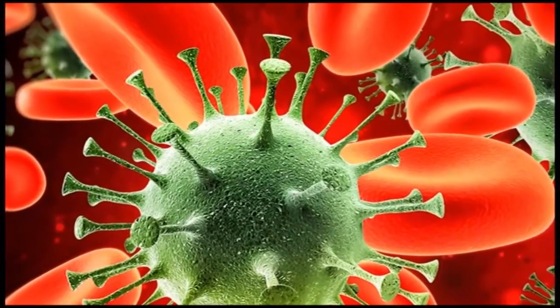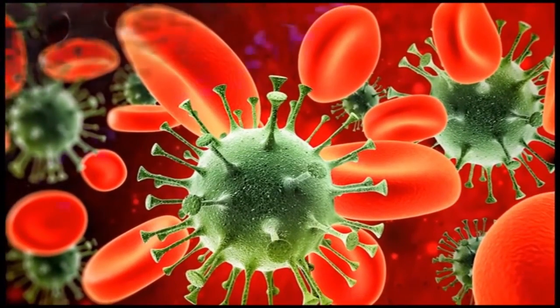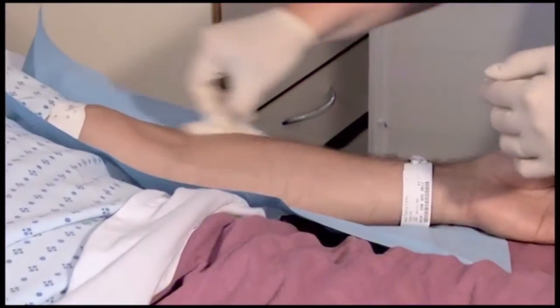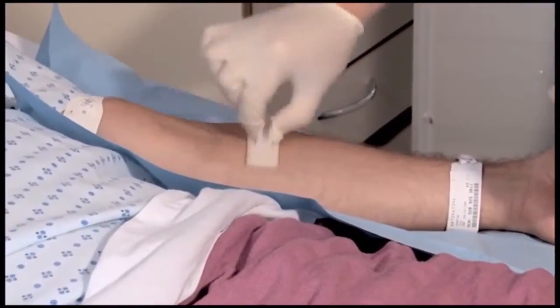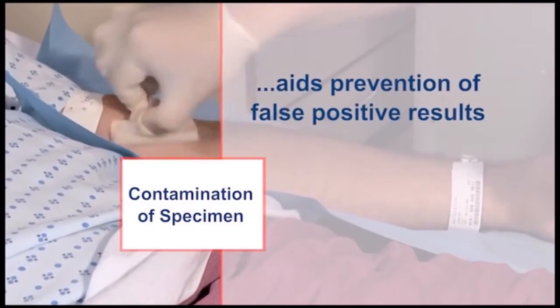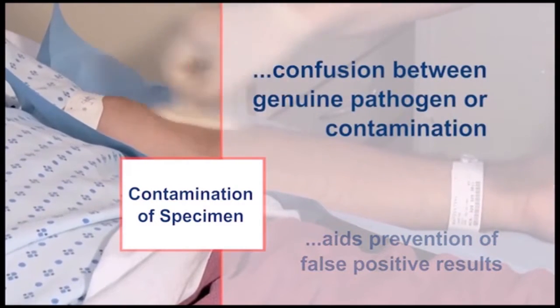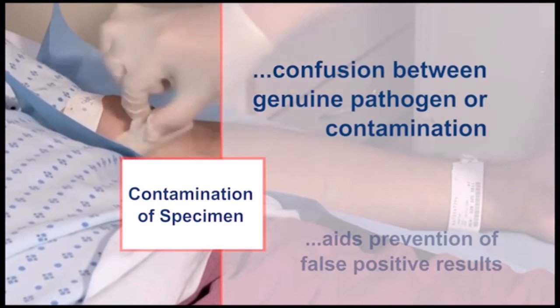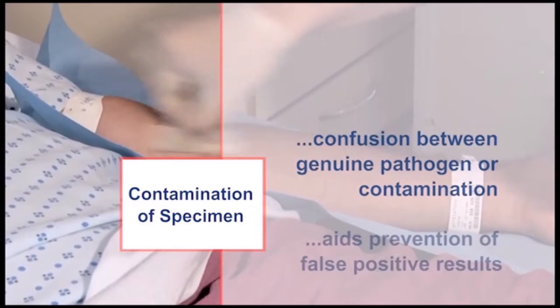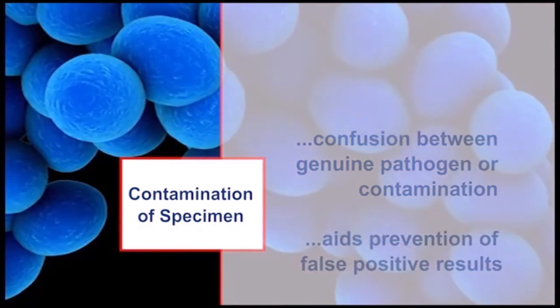Microorganisms are present on the skin surface of patients, staff, and the immediate patient environment, and can easily contaminate specimens. Coagulase negative staphylococci are the commonest blood culture skin contaminant, and therefore proper cleaning of the skin is a vital component of venesection and aids in the prevention of false positive results. These results can cause confusion due to the difficulty in determining if a positive blood culture is due to a genuine pathogen or due to contamination of the specimen.